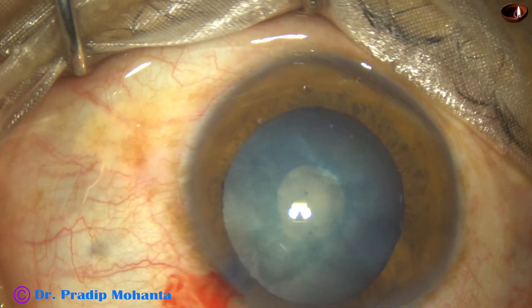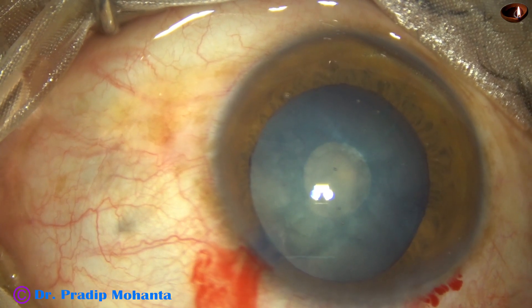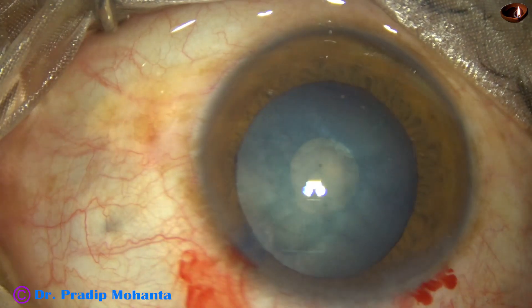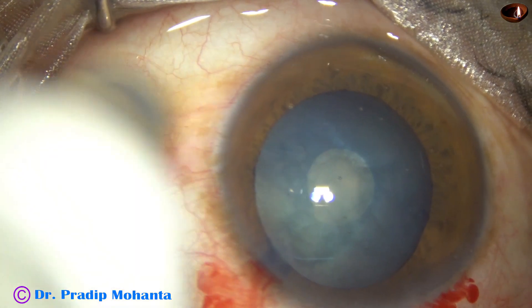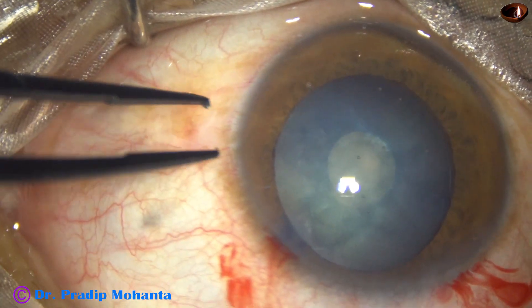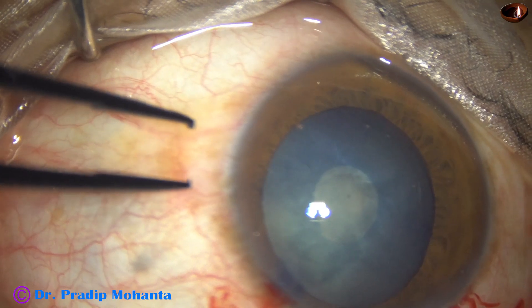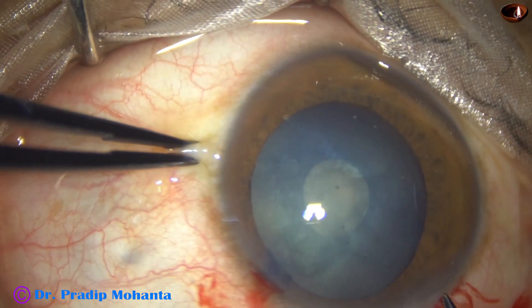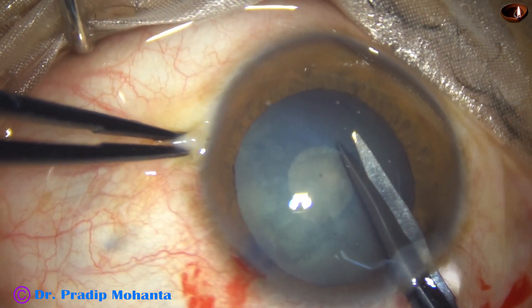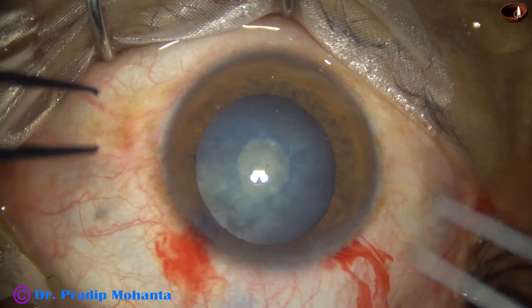Here goes the visco — this is 2% HPMC. Now I take a Vannas scissor. The patient is under topical anesthesia and is cooperating well, but is not able to fix the eye in one position, so I have to frequently instruct the patient to look at the light.